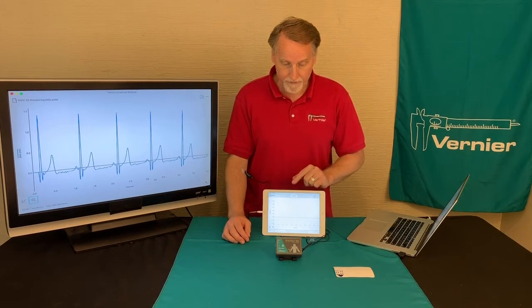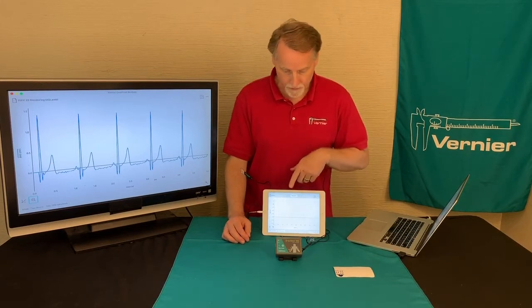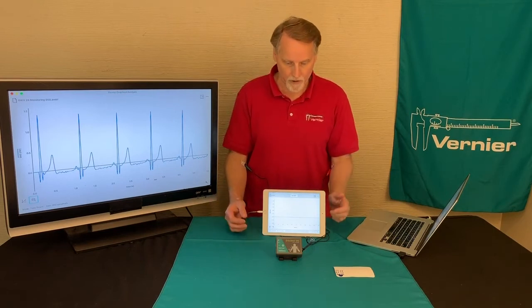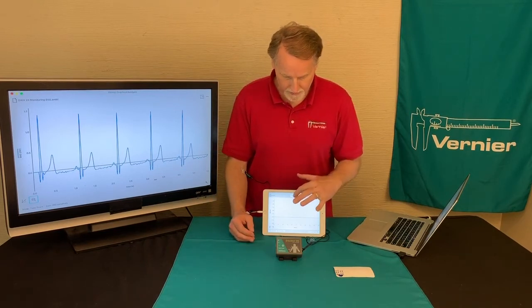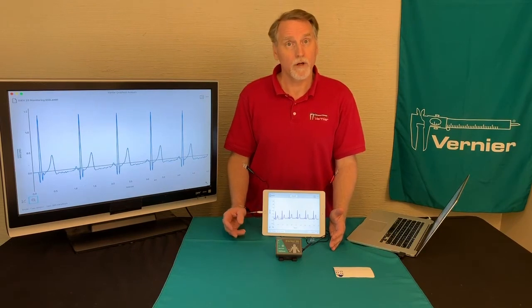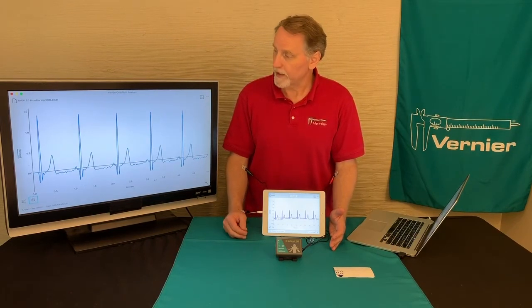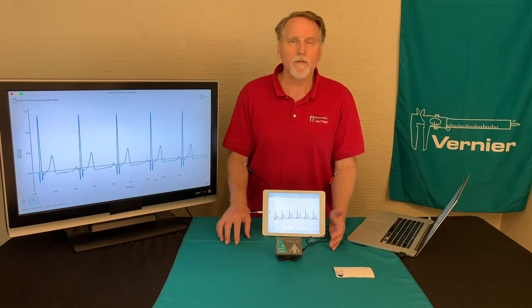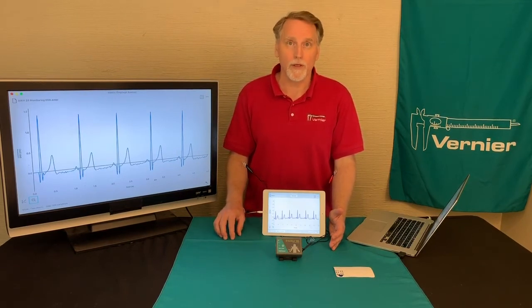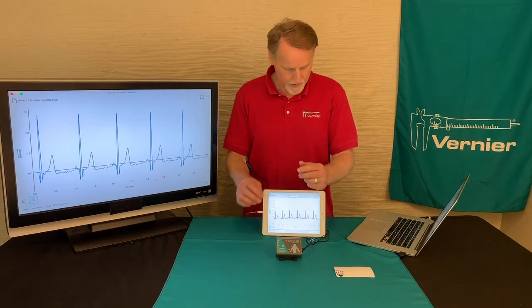Now, I've connected my EKG already to my iPad, and I have these conductive tabs already on my arm. And watch what happens when I hit collect. So we end up with a trace for my heartbeat here. And the lab would like for you to look at the different parts of the waveform of the heartbeat in more detail. So let me show you how you can do that.